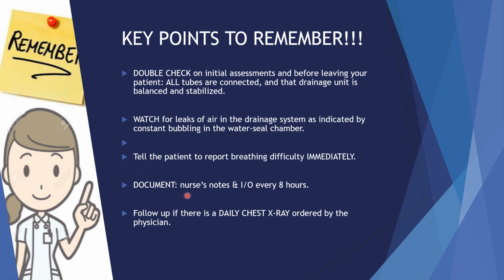And then we want to make sure that we're documenting. We need to document all of our output on the I&O. This says every 8 hours. We're probably on an 8-hour thing. In ICU, we're going to be documenting that every hour. And then out on a telemetry or med surg floor, you're probably going to be documenting it every 12 hours. But I would certainly get into the habit of doing it at a minimum of every 4. I think that would be a good best practice. That means you're looking at it a little more often, and you're going to be able to catch any complications or excessive drainage earlier. And then we're going to make sure that we're checking those orders and ensuring that we have follow-up chest x-rays and everything as ordered by the physician.